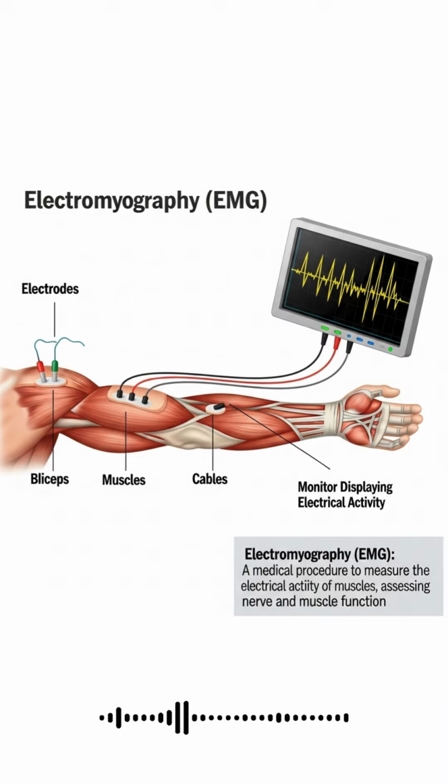Every time we move, like when we're walking or throwing a ball, our brain is sending signals through our nerves to our muscles. EMG is a tool that records the electrical activity in our muscles as they respond to those signals. It helps us figure out when a muscle starts working, how long it's staying active, and how strong that activity is going to be.